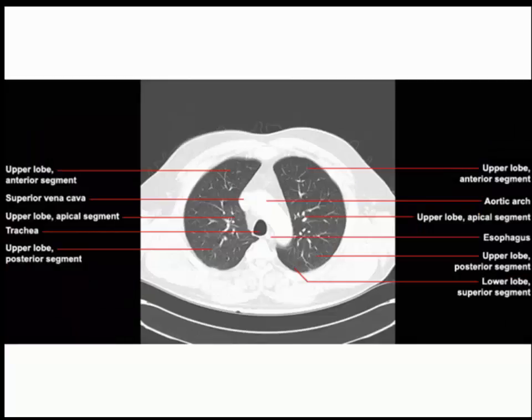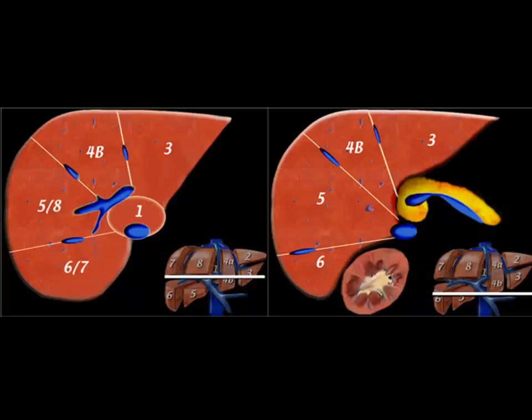Now, oh yeah, number 1 I haven't got here, so it will be this one, the caudate lobe. It's where the IVC enters, and then it is separate. It becomes very prominent when the liver starts failing and you have cirrhosis. So how to identify the patient is developing cirrhosis?